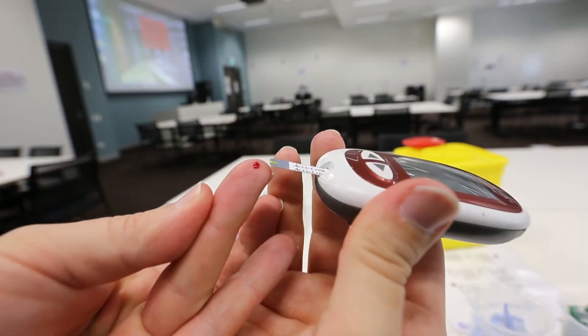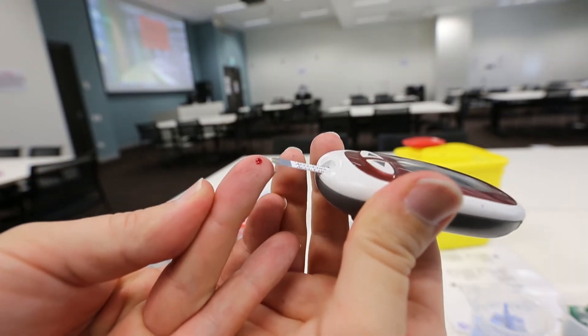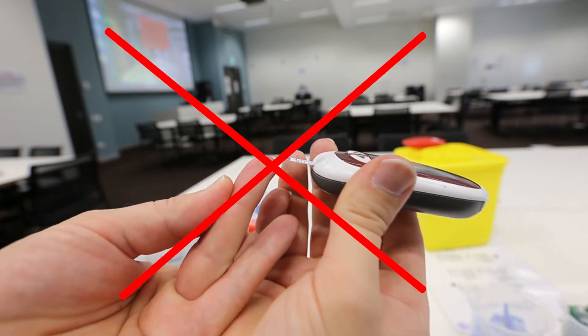Try not to approach the blood droplet at too shallow an angle, or the blood won't be drawn into the test area.